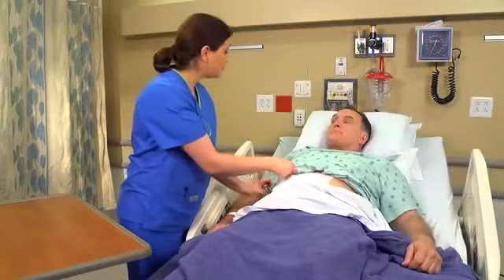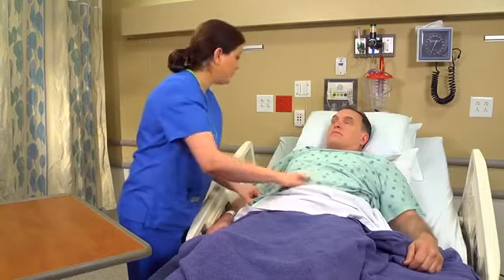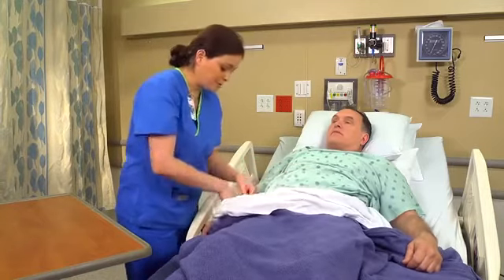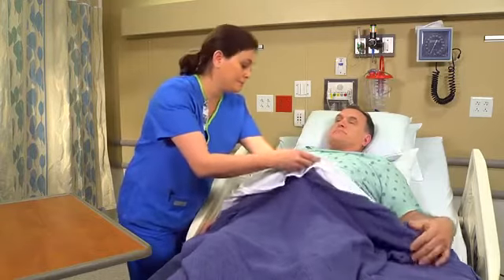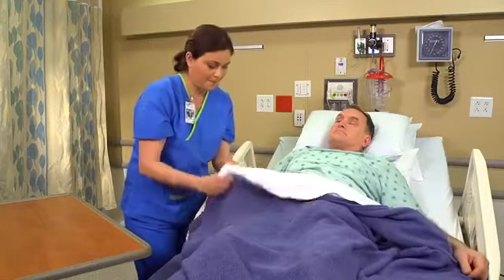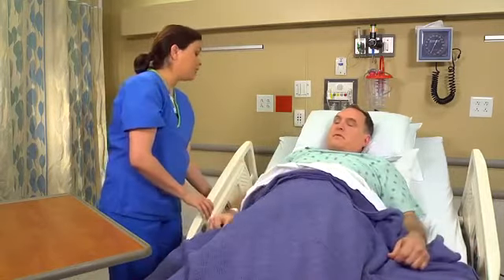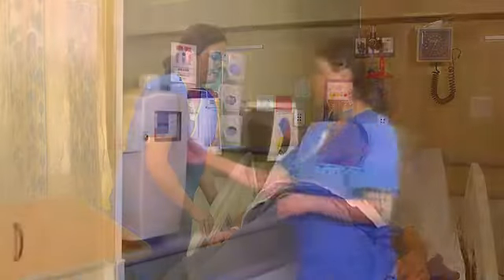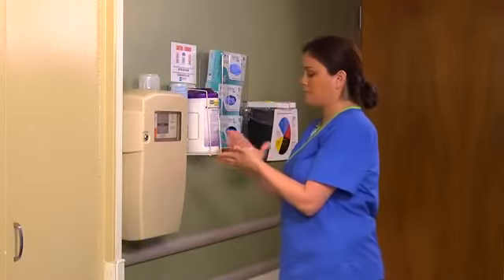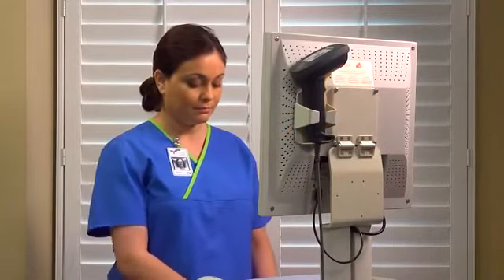Now that we're done with your dressing change, how would you rate your pain now — zero being none, ten being the worst? Help the patient into a comfortable position and ask him to rate his pain on a scale from zero to ten. I will come check on you in a little bit — you let me know if you need anything. Perform hand hygiene. Document your wound assessment and how the patient tolerated the dressing change.